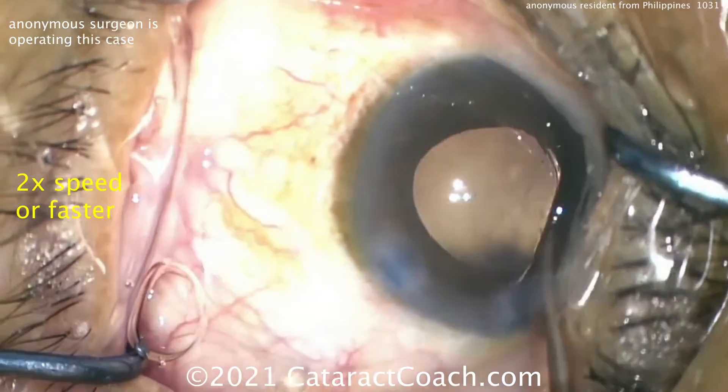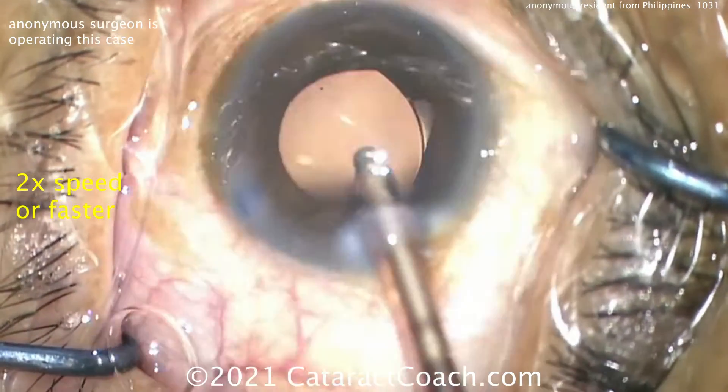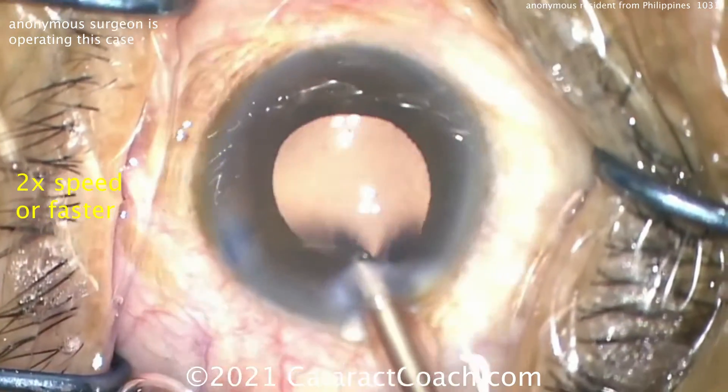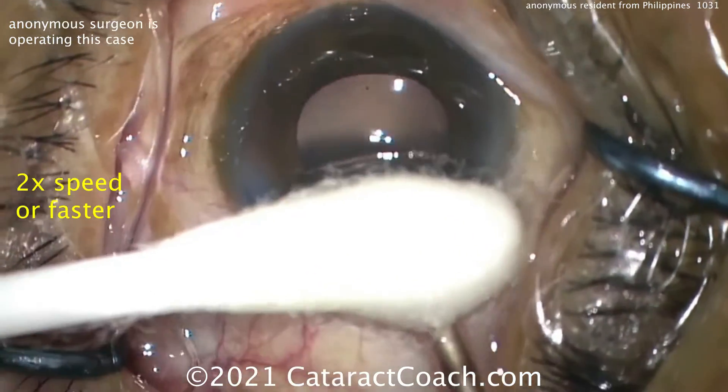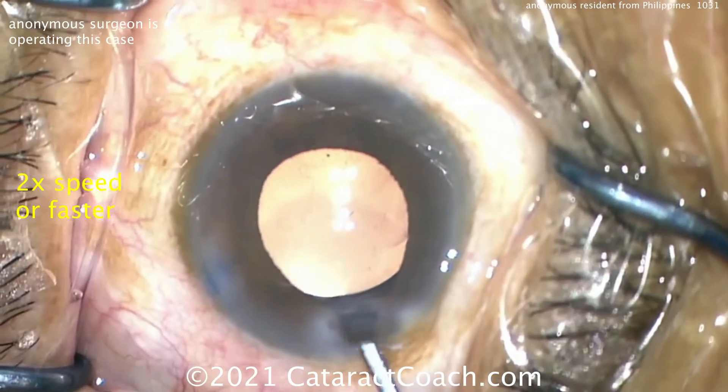To summarize, here are the things to improve: one, get that incision better; two, make a smaller capsulorhexis; three, keep the eye in primary position while you operate; and four, use the high vacuum mode of the phaco to achieve holding power while you do the chop. But otherwise, the case is great — you're doing a fantastic job, keep up the good work.